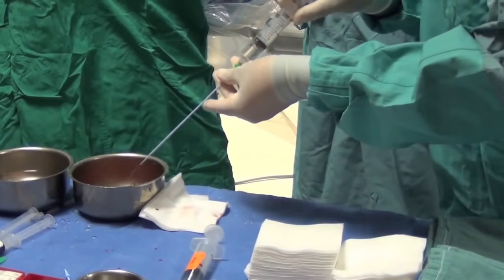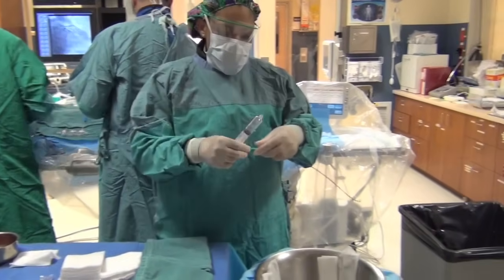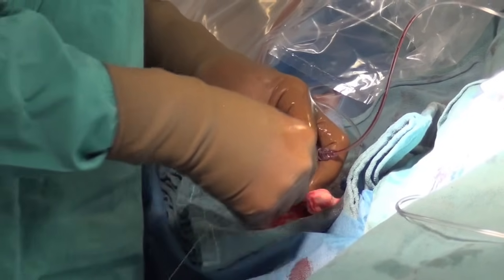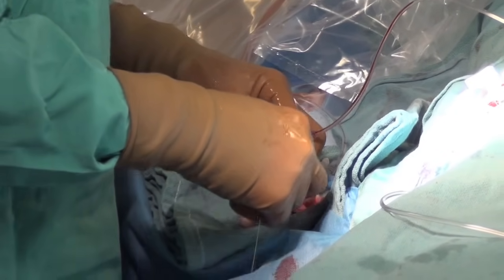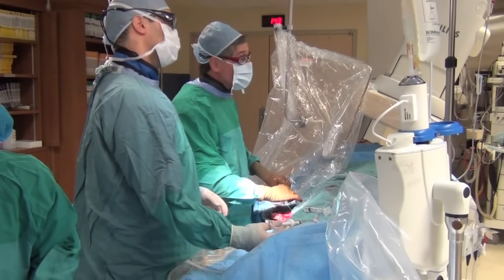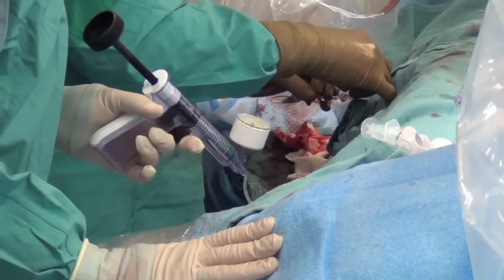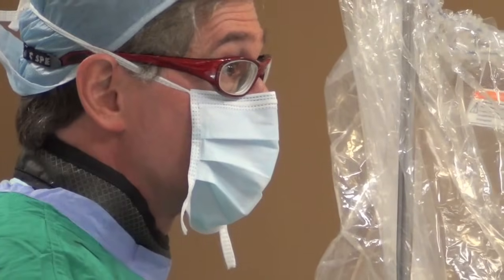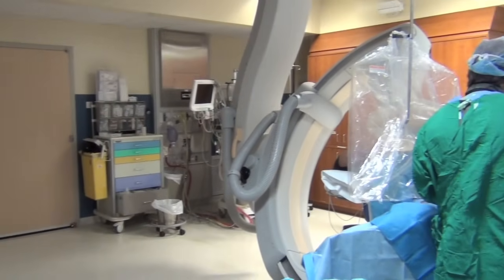We're getting set up to proceed with what we call an angioplasty or stent procedure. We use a very fine guide wire which is threaded through the narrowed area of the artery, and then we insert a small balloon. Everything is very small here — the arteries themselves are only two or three millimeters in diameter. We insert the balloon and then inflate it to stretch the artery a bit. That makes room to bring the stent in, and in this case it required more than one stent to fully open the narrowed portion of the artery.